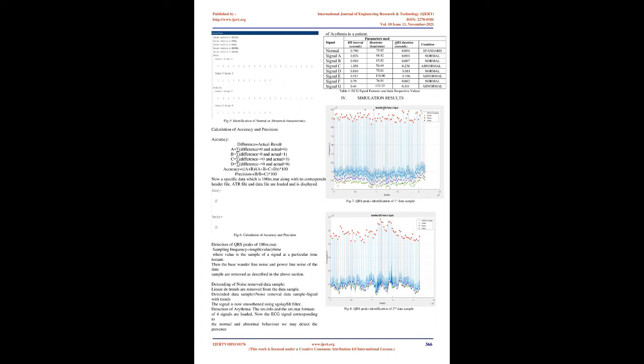B. Parameters used and its calculation. The parameters used for the analysis of the arrhythmia are the QRS complex, which is calculated with the help of QRS duration, RR interval, and heart rate. The process to find its calculation and location is described below. Calculating R, Q, S peak and its location: the standard QRS interval is considered as 0.094, and in order to access the samples, round them to the nearest integer less than or equal to that value. MATLAB syntax: Sample = floor(sampling frequency * standard QRS interval / 2).